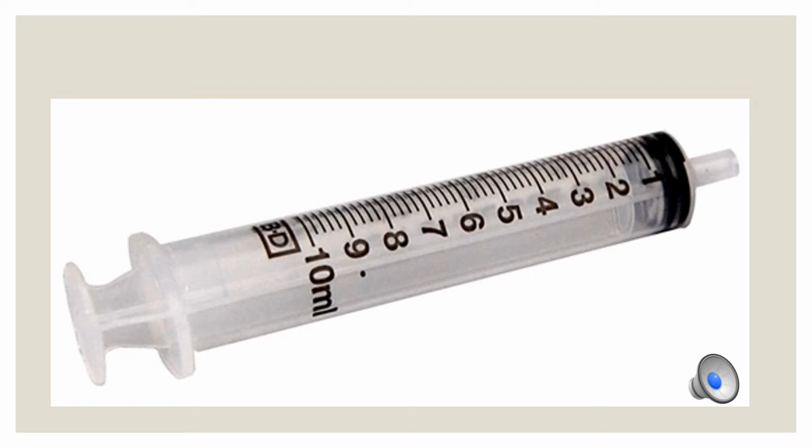So we're going to take our 1 mL of morphine and dilute it with 9 mL of normal saline because the textbook says it's safe to dilute morphine with saline. So now we've used all 10 mL on our syringe for a total of 50 lines. And we know we need to give this medicine over 5 minutes. So 5 minutes times 60 is 300 seconds. So 300 seconds over 50 lines equals 6 seconds a line.